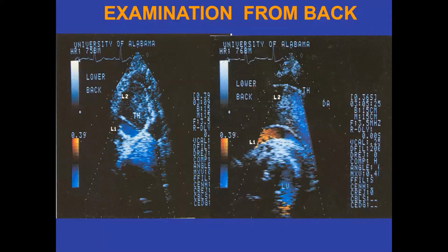Perfect. I think you just answered about the pulmonary veins. You just answered the next question, which was how to view atrial appendages. So I'll move on to the next question. The atrial appendage. Yeah. So can I take the next question?